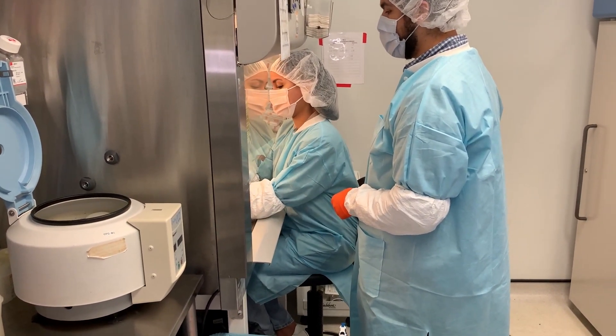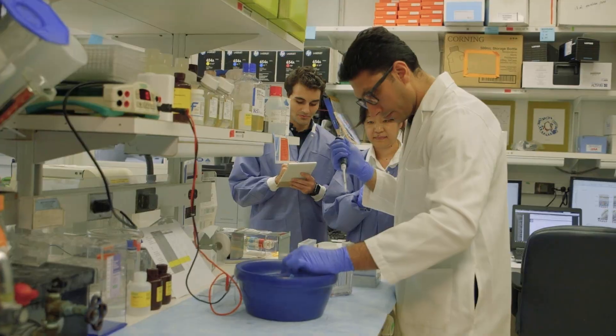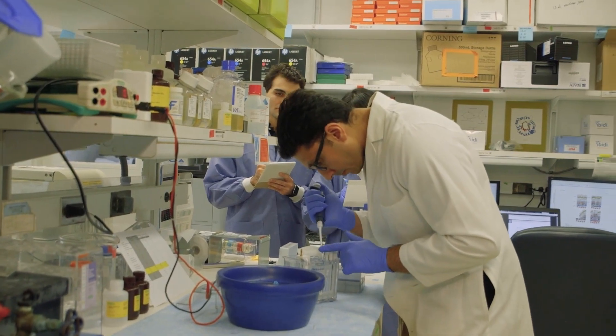All the reagents and equipment are described in the protocol. We have also described the specific details and tips so that you can have a successful run of manufacturing RPEs from iPS cells.